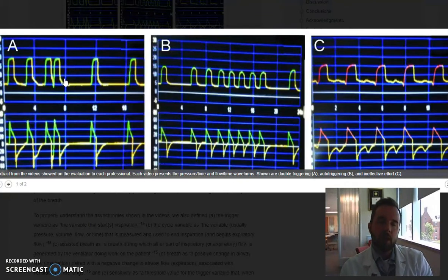You'll typically see the tidal volume spit out on the ventilator to be in the 800-900 range because it's two breaths together, stacked right on top of one another. What's the solution for this? Well, you should extend the inspiratory time on the ventilator. By extending the inspiratory time such that it's longer than the patient's intrinsic inspiratory time, you should avoid that second breath.